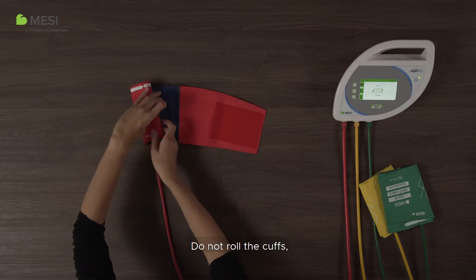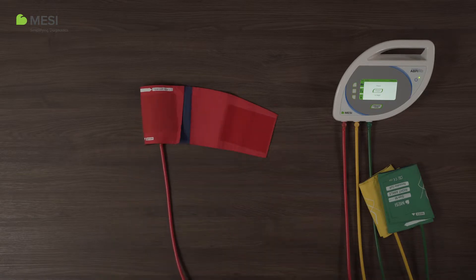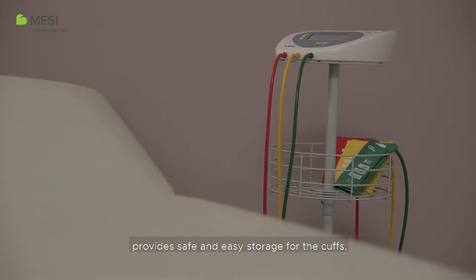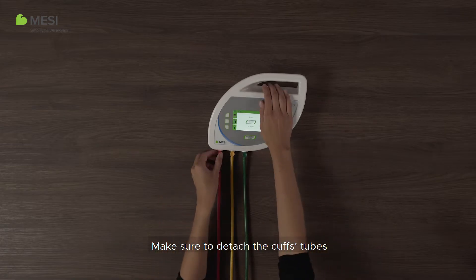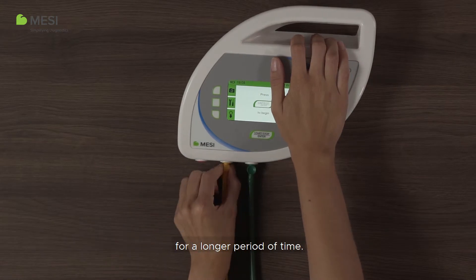Do not roll the cuffs, crumple them or leave them unfolded. The ABP-IMD stand provides safe and easy storage for the cuffs, preventing the cuff's tubes from tangling and damage. Make sure to detach the cuff's tubes if you plan to not use the device for a longer period of time.